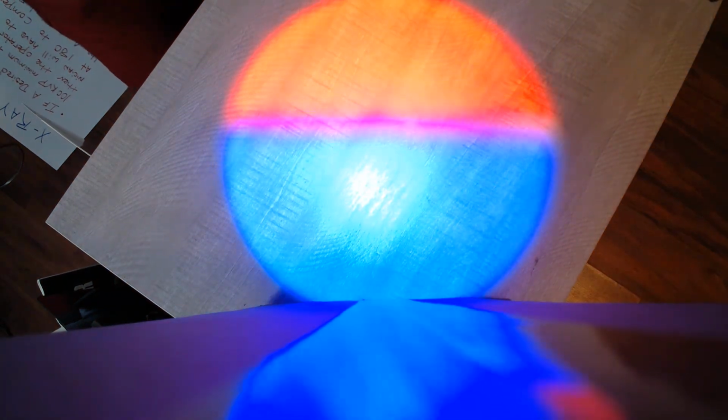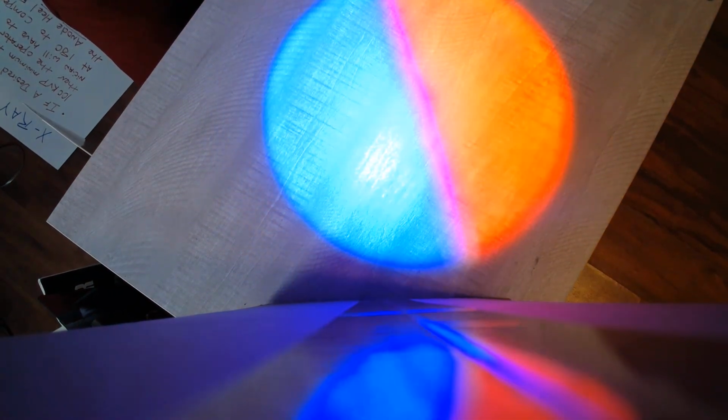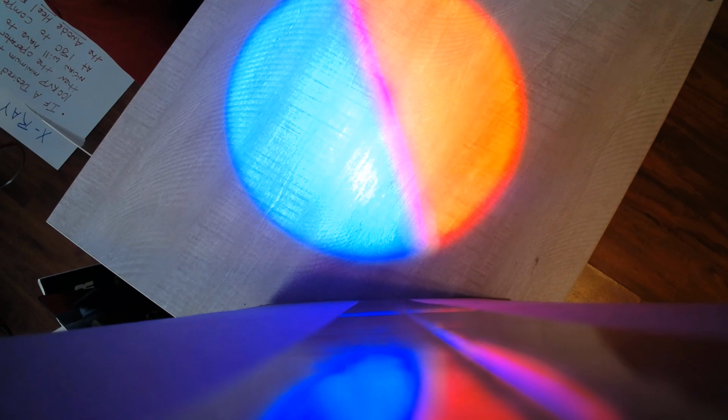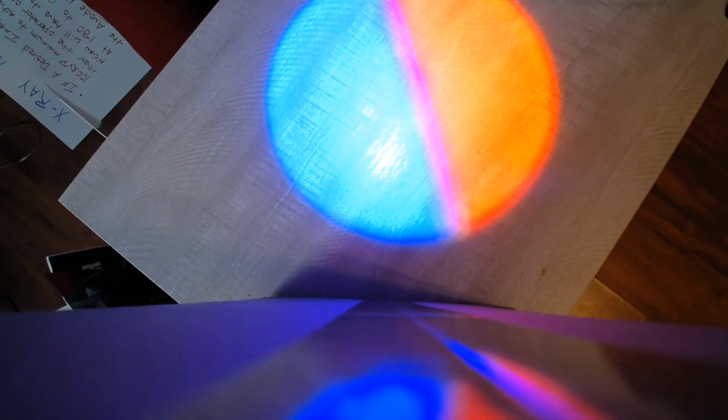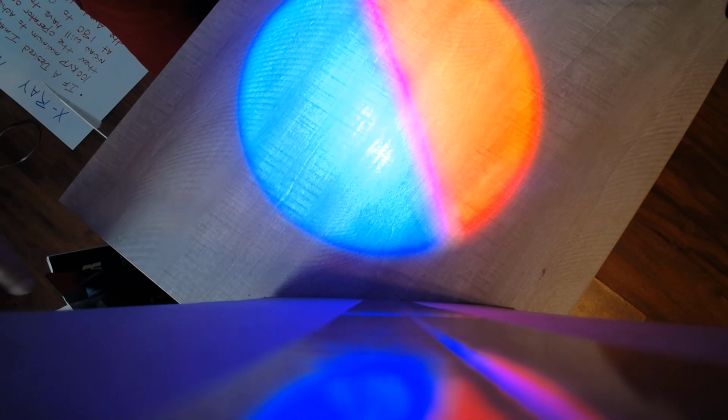Imagine this is the X-ray table, and there's your X-ray beam, and it shows the cathode and the anode side. Let me turn this a little bit. Okay, that's about the best I'm going to get.